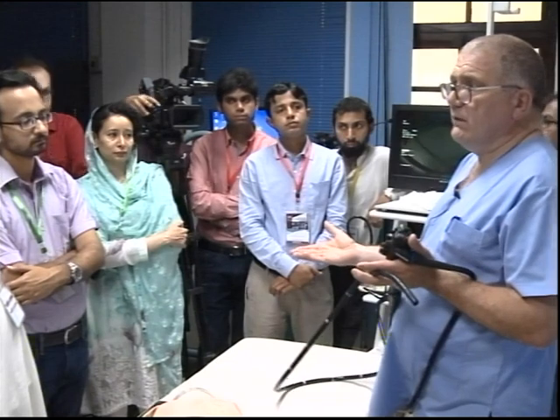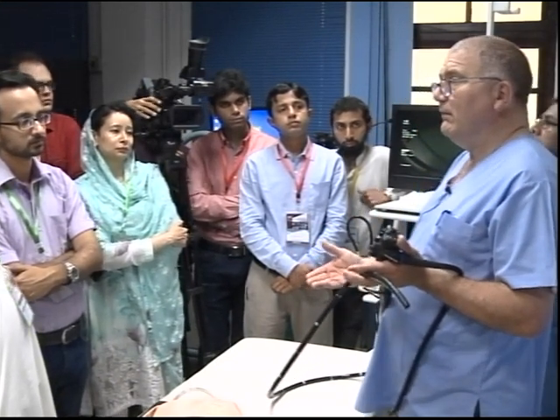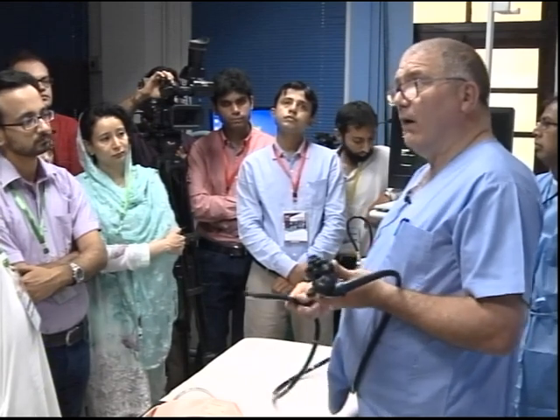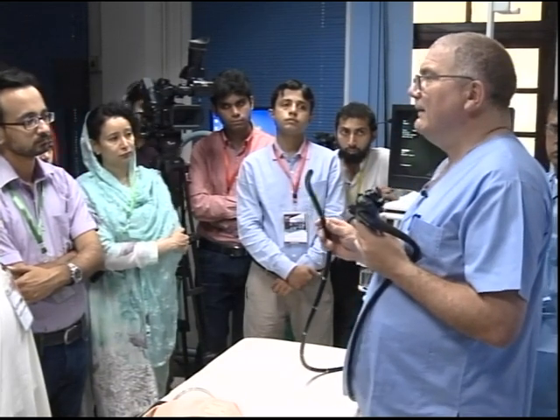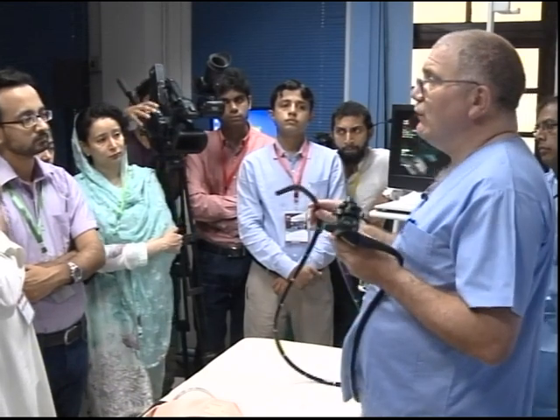Suspension. That's one. So you know there's something wrong with it. Would you drive it? No. Could be a wheel missing, could be a flat tyre. So you wouldn't drive a car because it would be, what? Unsafe. Why would you use a scope if your view is impaired? So what I'm saying to you is, if you can't see clearly where you're going, you need to rectify it.